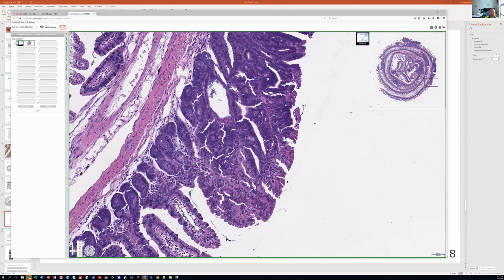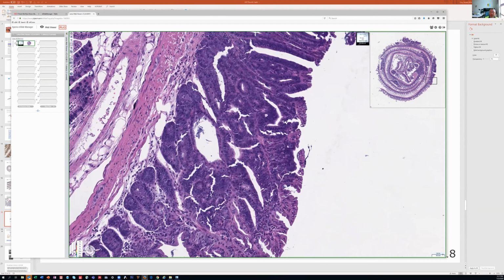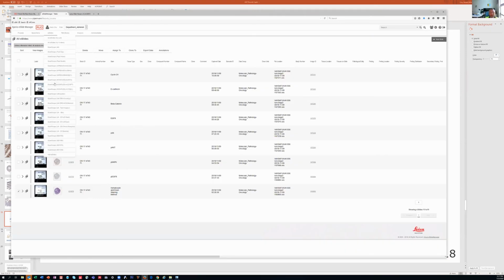Yeah, I've seen that for sure, and I've always assumed that's the more normal, although reactive, kind of stretched over the top. Exactly. So it grew from underneath, and it's just a layering. And when you look at the very early adenomas, they arise somewhere down underneath in the crypts. They don't arise at the top surface. Right, and then they burst through.